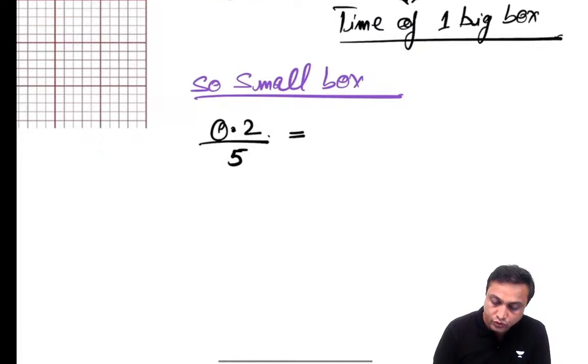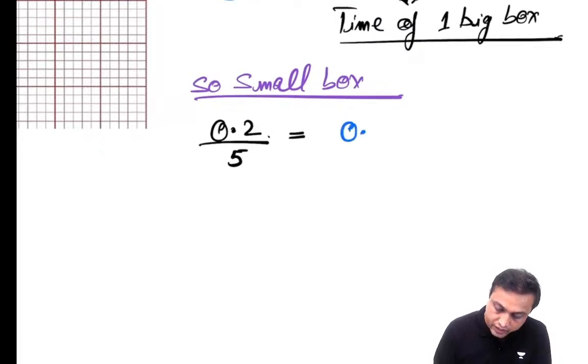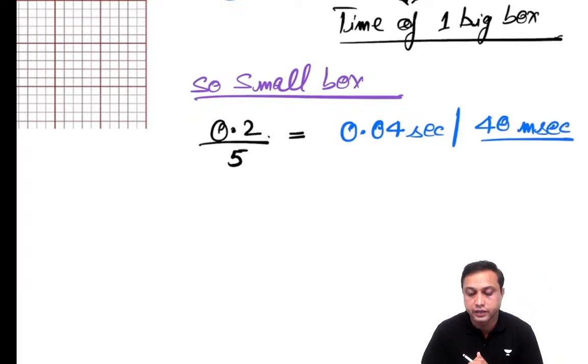How much is it going to come? It is going to come 0.04 second. Or if you want to learn in milliseconds, it is going to be 40 milliseconds. Right? So simple. Guys, trust me.